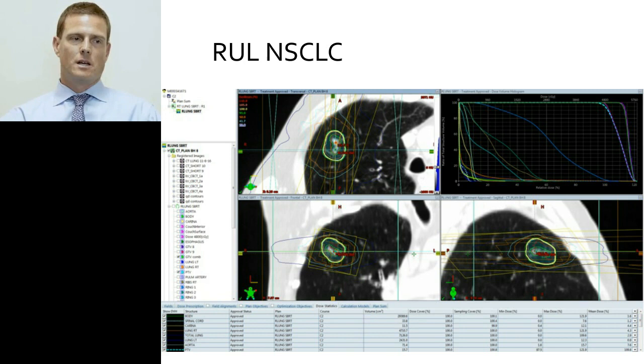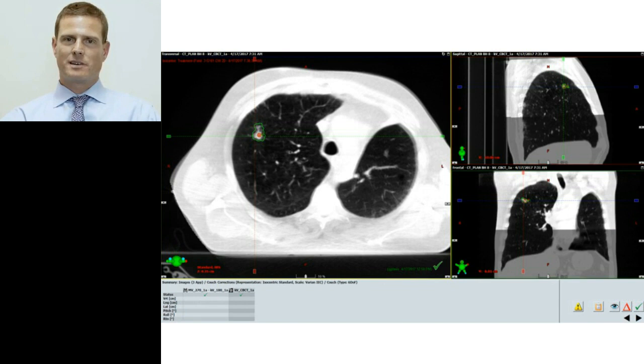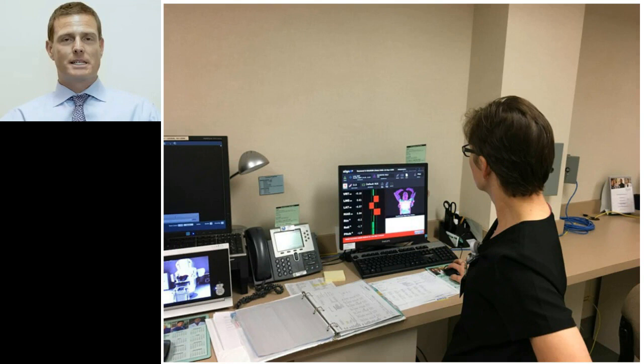At the time of treatment delivery, we again perform KV-OBI for positioning verification. We also do cone beam CT. It usually takes 2 breath holds to get through the cone beam CT, so that too is sort of an aggregate over 2 breath holds to see reproducibility of the breath hold. After appropriateness of positioning is confirmed, we obtain a new reference surface image with the AlignRT system by having the patients take yet another deep breath.